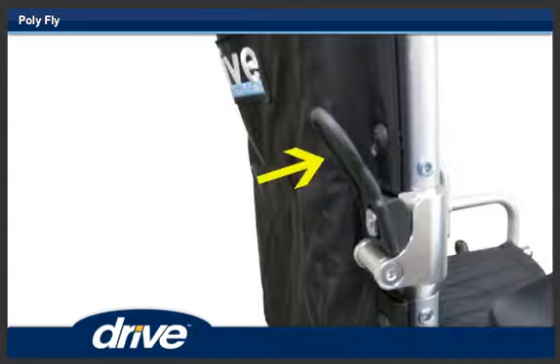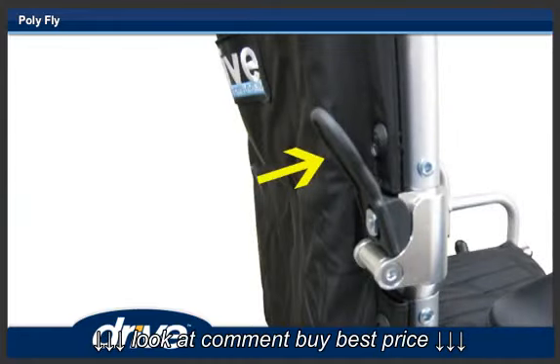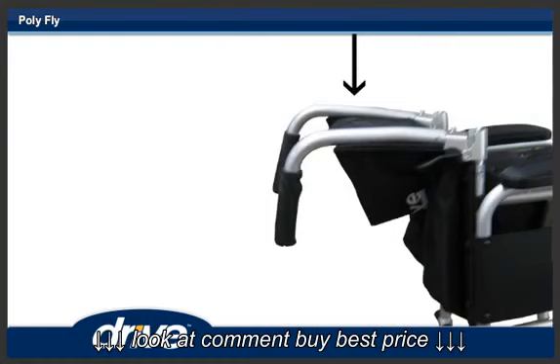Step 2. To fold down the back, push in both back locking levers and let the back fall down.